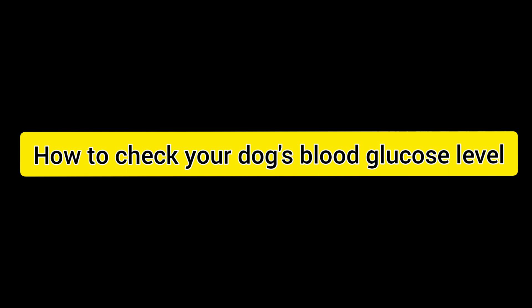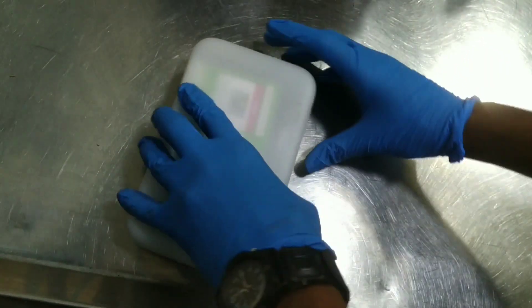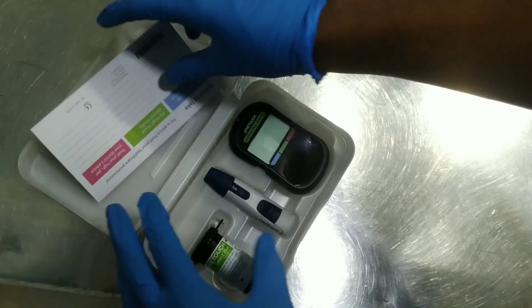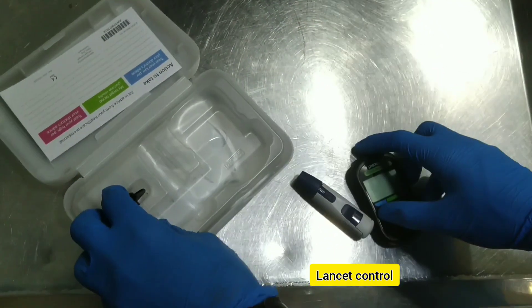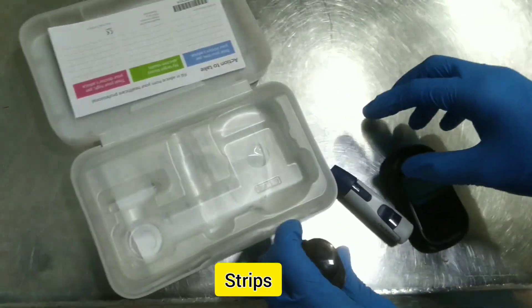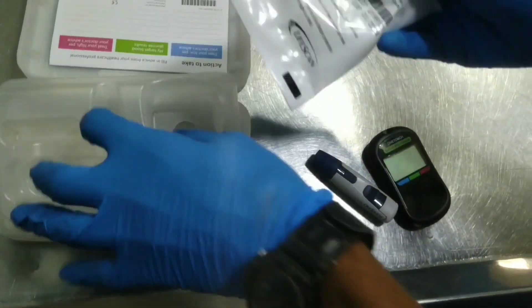Today we are going to see how to check your dog's blood glucose level at home. For this we need a glucometer kit. It contains the glucometer, the lancet holder, the test strips, and the lancet.